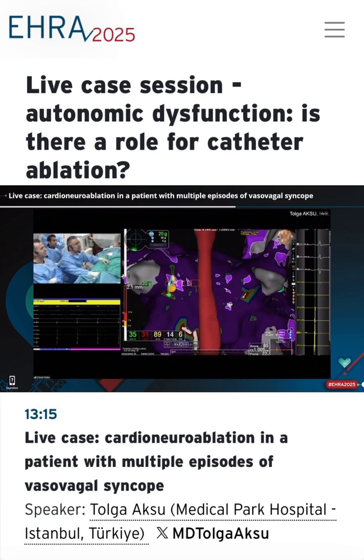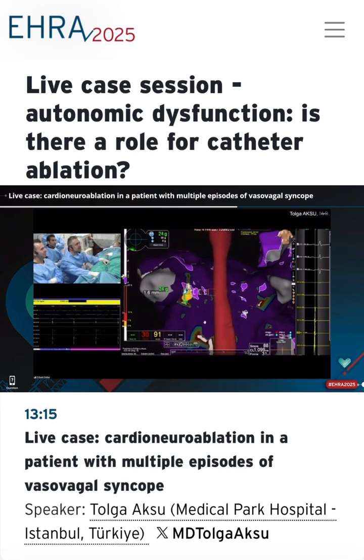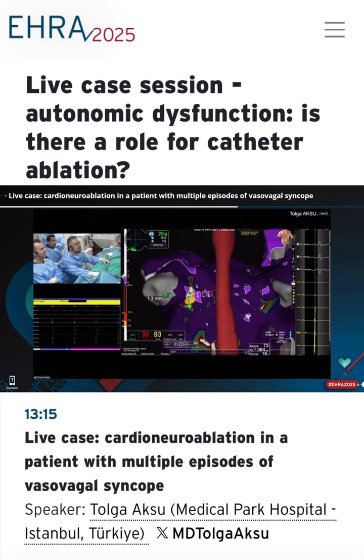We eliminated the electrogram, but there is no vagal response. This is a very, very tiny GP site, and you cannot see anything on CT. But according to our classical approach, we are performing ablation in that site as well. If we are seeing any vagal response, our second ablation endpoint will be elimination of this vagal response. Again, it's the same in all these GP sites.